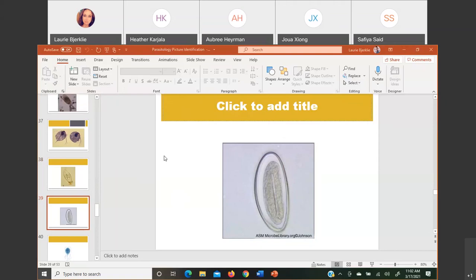So, of course, this technique that we've all discussed with pinworms is the Scotch tape method. Or they have what we call pinworm paddles, basically the same principle, sticky, so that they can stick around the anal area, because that's where they like to lay the eggs. And then you look at a microscope and you look for this little nice wormy. Of course, the key characteristic of Enterobius, or the pinworm, is that it has kind of a slightly flattened side to it. Look there.